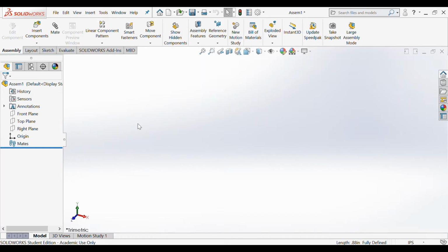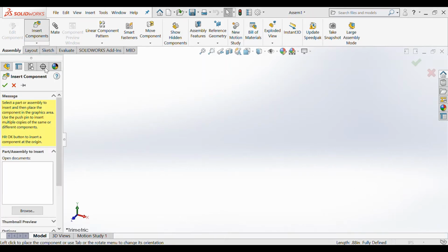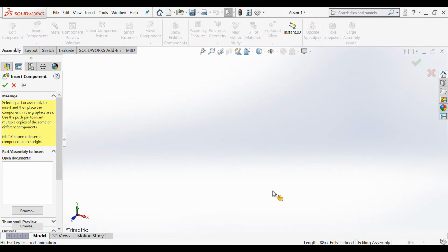Today I'm going to show you how to assemble our surgical suturing device. So go on ahead and open up SolidWorks and choose Assembly. And then once it's open, choose IPS as your units. And then we're going to go on ahead and insert the first component, which is the half of the handle.